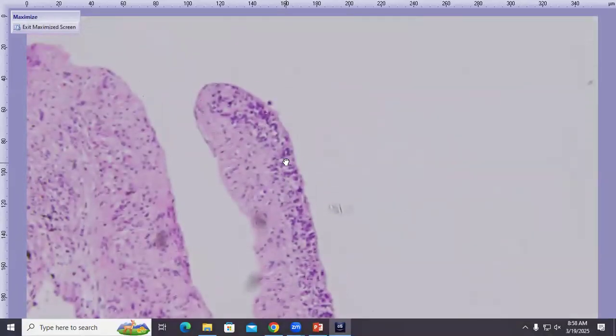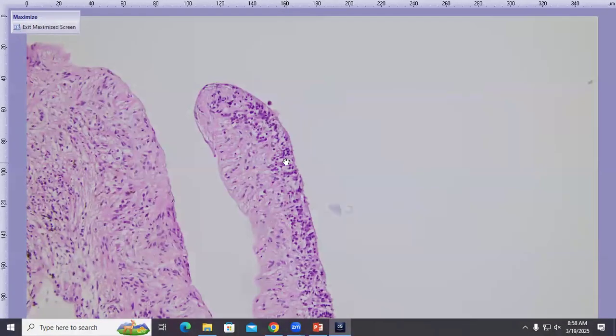And we can tell that it's a real in vivo retinal tear because we do have this rounded end when the retina tears in the body. It sort of has this rounding up action that it does. Artifactual tears tend to be more boxy and sharply discontinuous at the torn end.